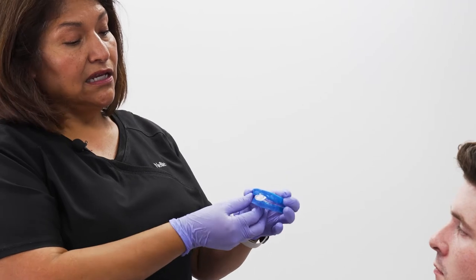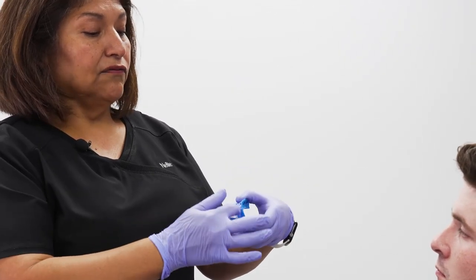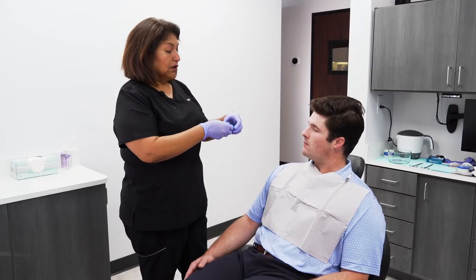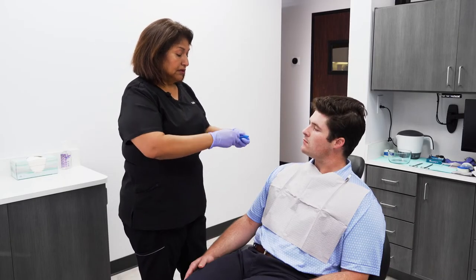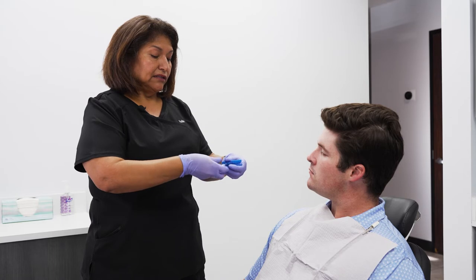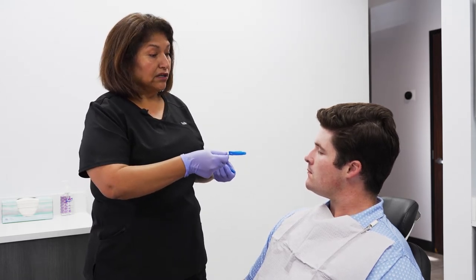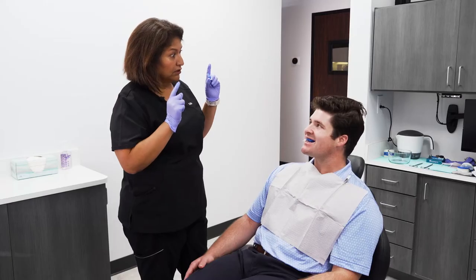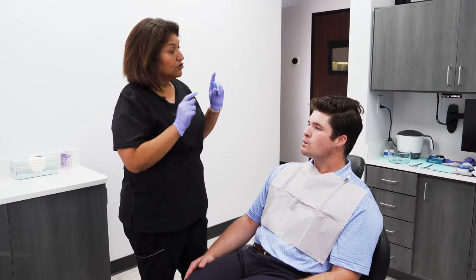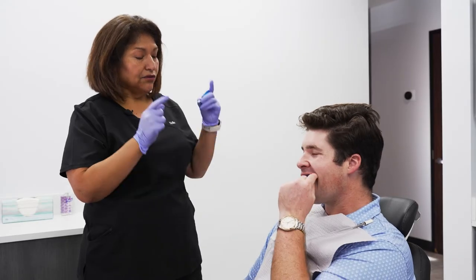As you can see, it's connected by the use of this little dial, a little adjuster, and a little flat post that's on the top. What we're going to do is remove it and separate it by removing the dial, and this is what we're going to do to fit it. We're going to start with the upper, and I'm going to have you just fit it in over the teeth, making sure that it fits nice and comfortably. We're looking for anything that might be sharp or uncomfortable on the gums or the teeth, but you should feel some pressure all the way around.